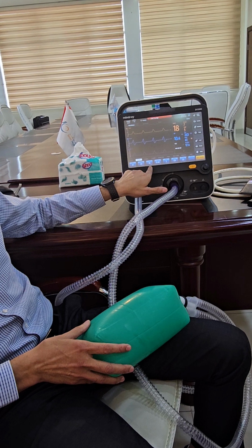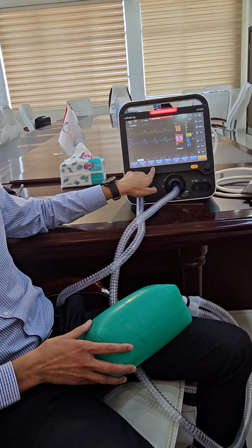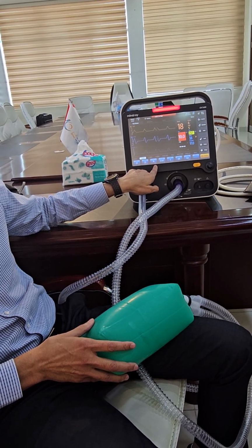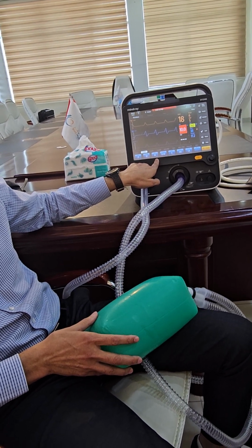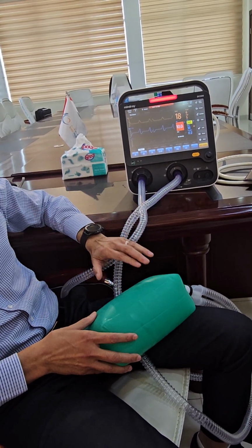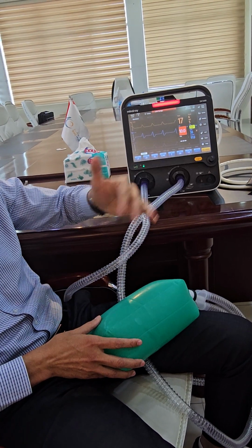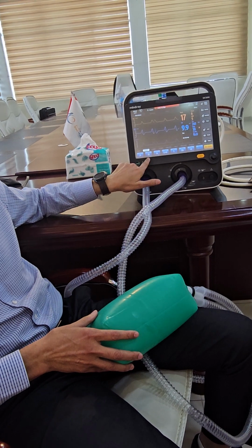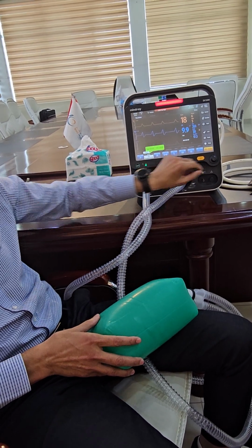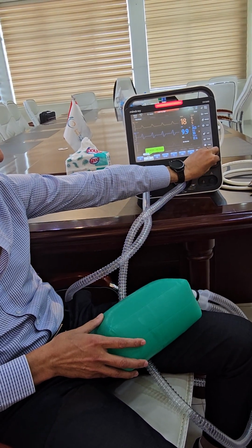Clear? So this is the rate. You understand what the rate is? Some people call it the backup rate. It's the number of ventilations that will be delivered by the machine, while the rate here shows everything: assisted, spontaneous, and the backup rate. So this is called the backup rate. This is the inspiratory time, the inspiratory pressure, maybe the delta, I'm not sure, I've never used one.